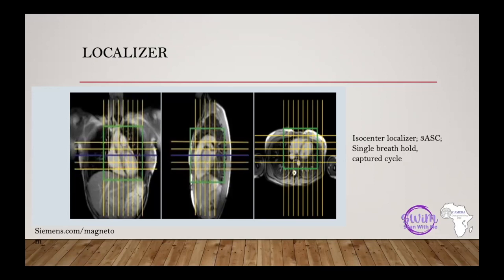And then you should be able to tell the patient to hold their breath during this period. I'd like to state something here, and that is, if you look at these images that I posted on this screen, you see this green box that comes this way.